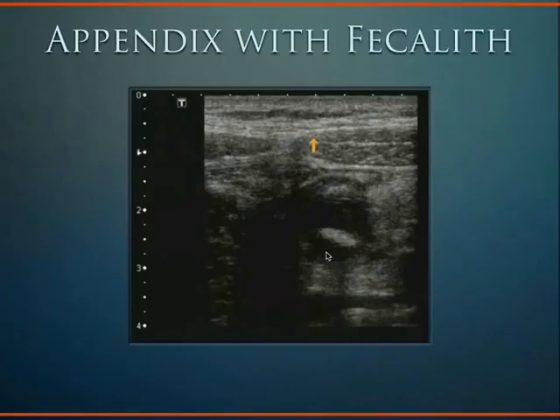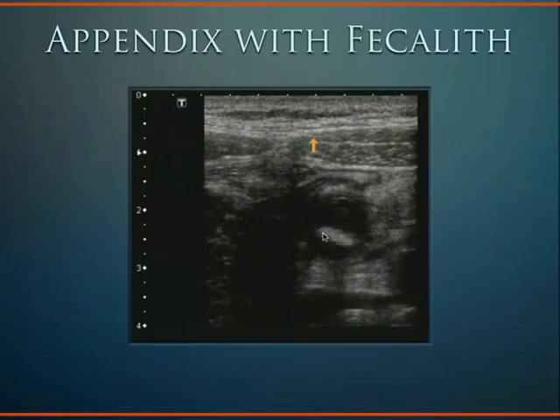and eventually you can get perforation in which that pus gets into the intraperitoneal space, and then you can have an abscess develop. When perforation of the appendix happens, you have about an overall 5% mortality rate in patients, which is why it's important to make the diagnosis before that happens. Now, 5% is really in older patients who are at risk for developing sepsis. It's much more tolerated in younger patients, actually. But we see here this appendicolith or fecalith.